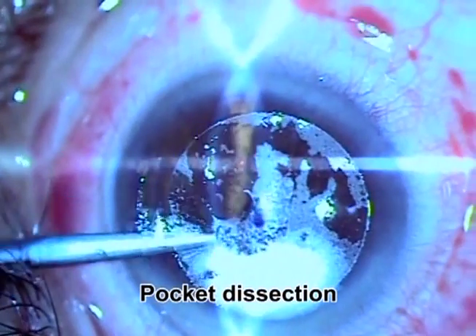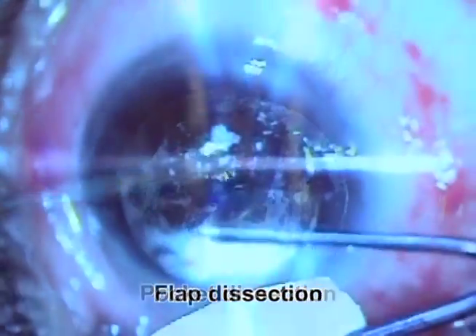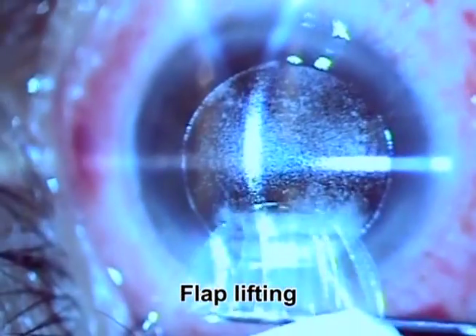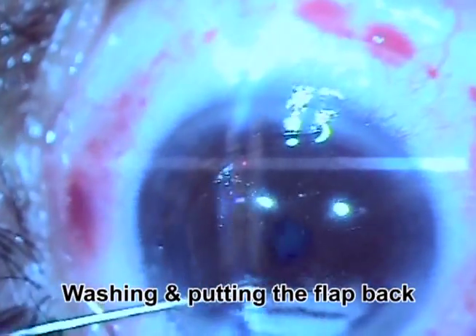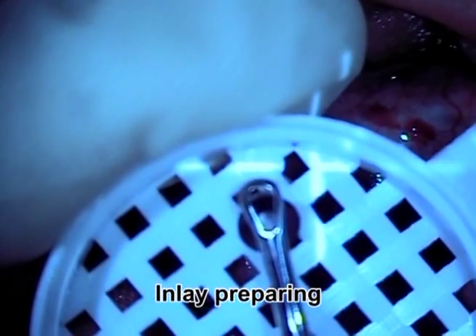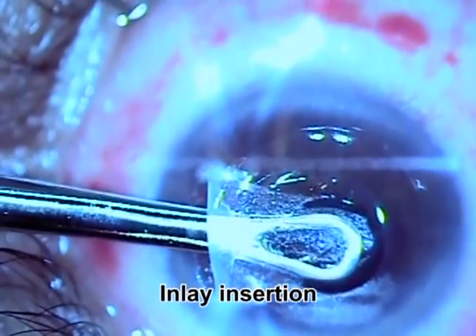We start by dissecting the pocket to make sure the procedure was complete and fine with nothing unusual, then we dissect the flap and lift it up. We prepare the patient for the excimer laser for distance correction, then wash the eye and put the flap back, finishing the LASIK surgery.